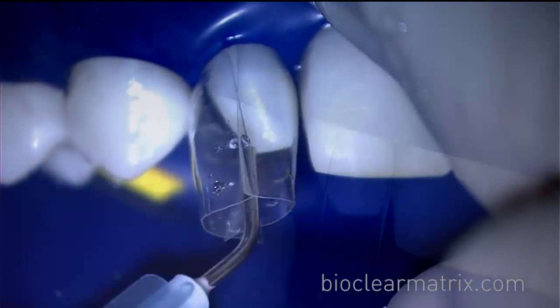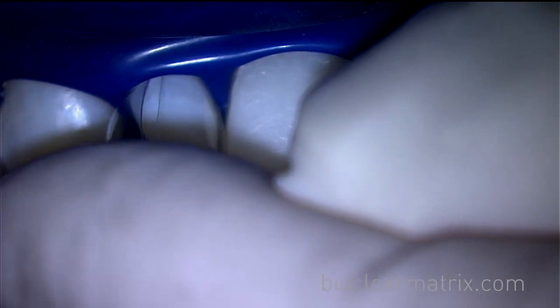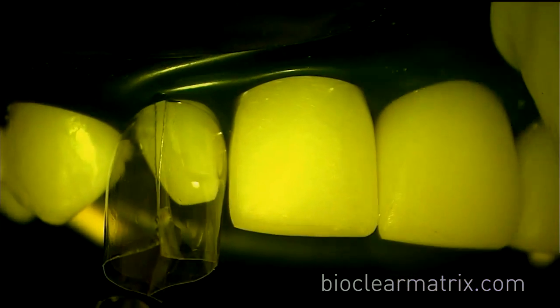With the matrices in place, etch the entire tooth, rinse, and dry thoroughly before starting the injection molding process. The first step of injection molding is to wet the entire tooth with adhesive.